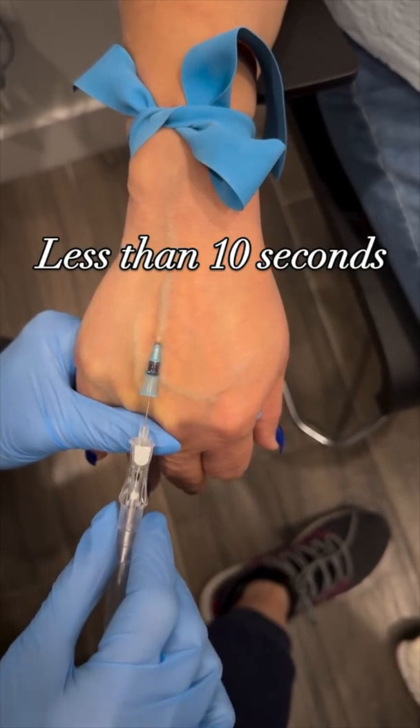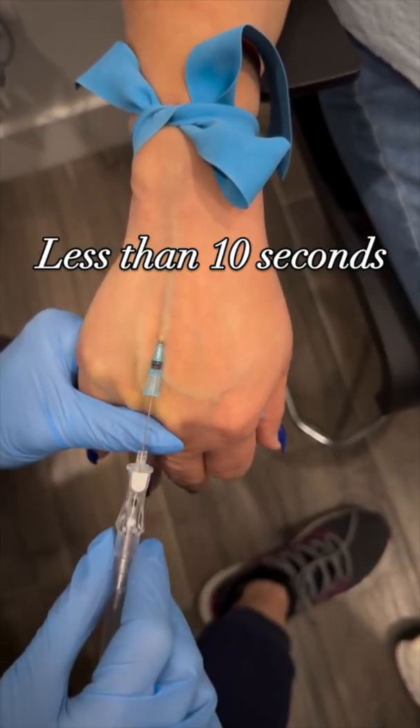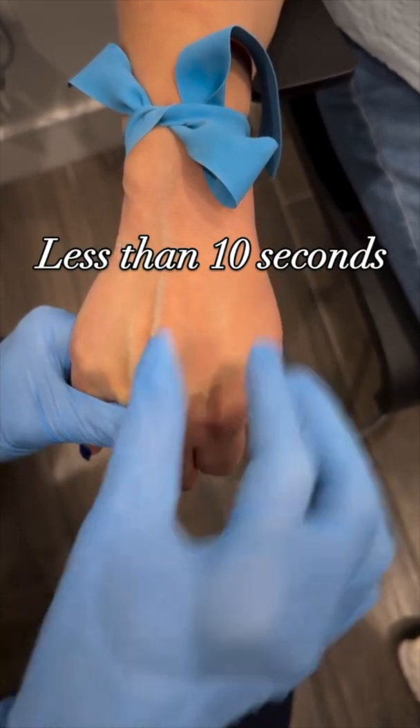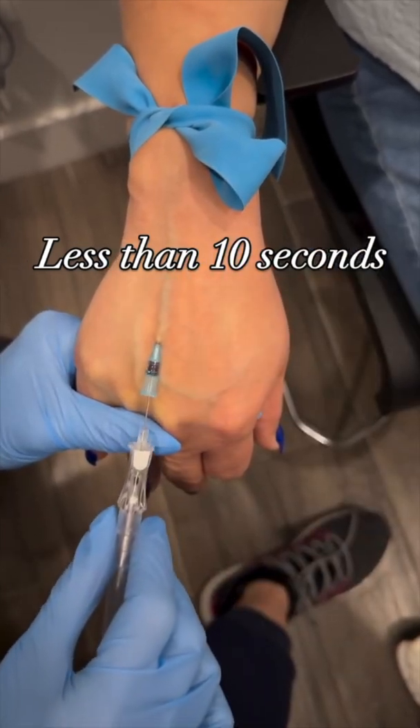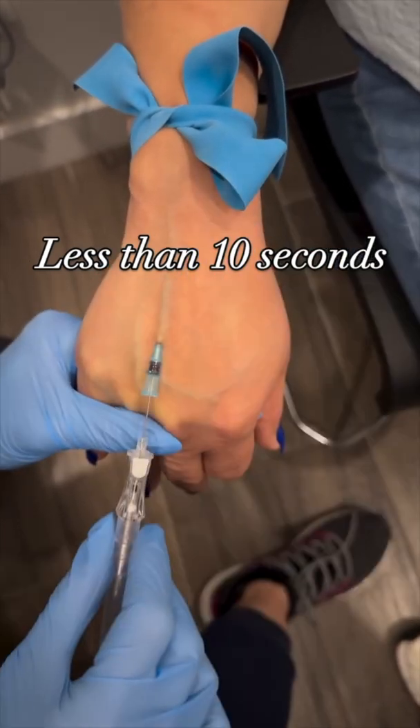One thing I know for sure that you shouldn't do is reinsert the needle after it's been withdrawn, which is what was done here. It looks like the needle here is withdrawn to make sure the flashback flows up the hub — I'm not really sure. But there's no need to do it to check for flashback; the catheter already has that function.